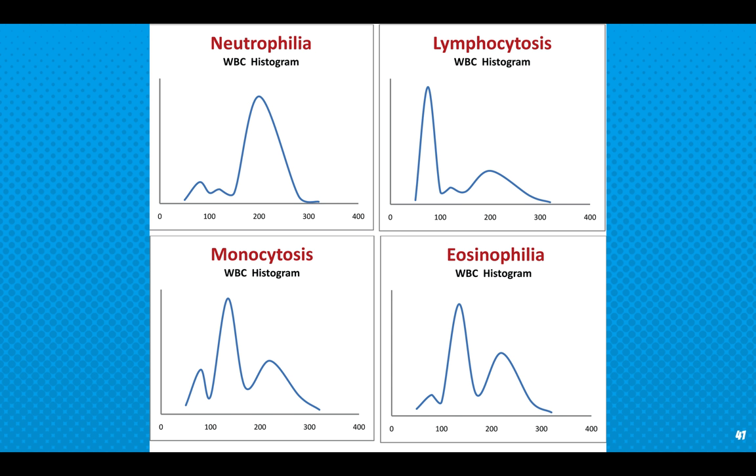Before that, I just want to show this. This is now the use of your histograms. Normally, this is the normal distribution natin: lympho, mono, eo, baso, and then neutrophil. You see a peak here, ang taas-taas. Ang taas nung third peak, so ibig sabihin there is an increased neutrophil. And I want you to start learning how to read these things, okay? If the third peak is so high, that is neutrophilia. Neutrophilia meaning there is an increased number of neutrophils.